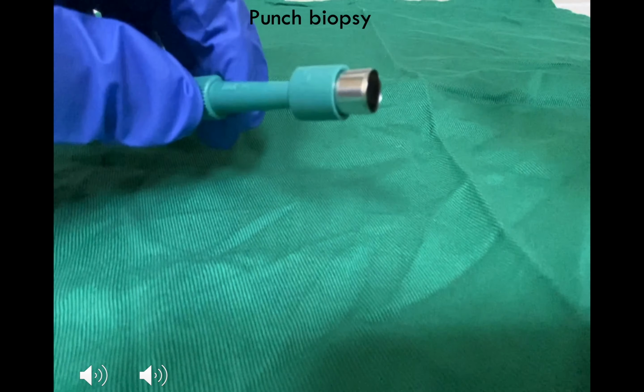And then for cutting, rotate the punch clockwise, and with some gentle pressure, push the punch inwards. So keep rotating and it will cut. I cut it at about 5 mm depth. Then slowly I rotate anti-clockwise to remove the punch. Now we can see there is a cutting mark.